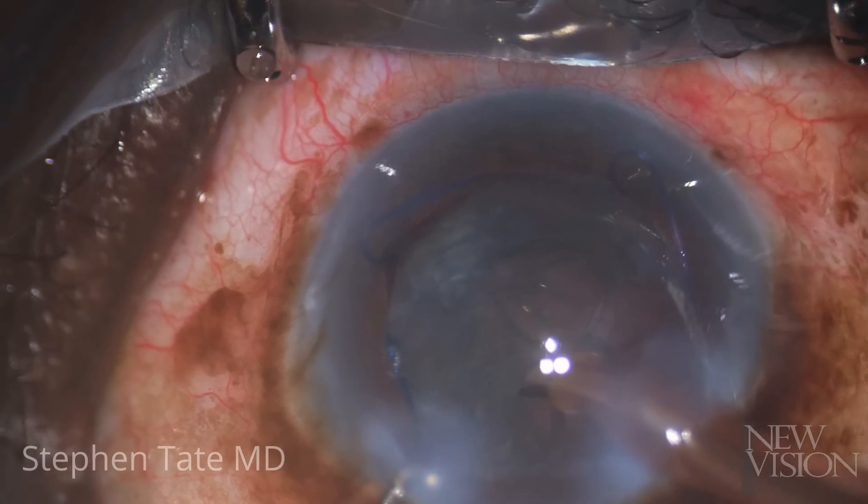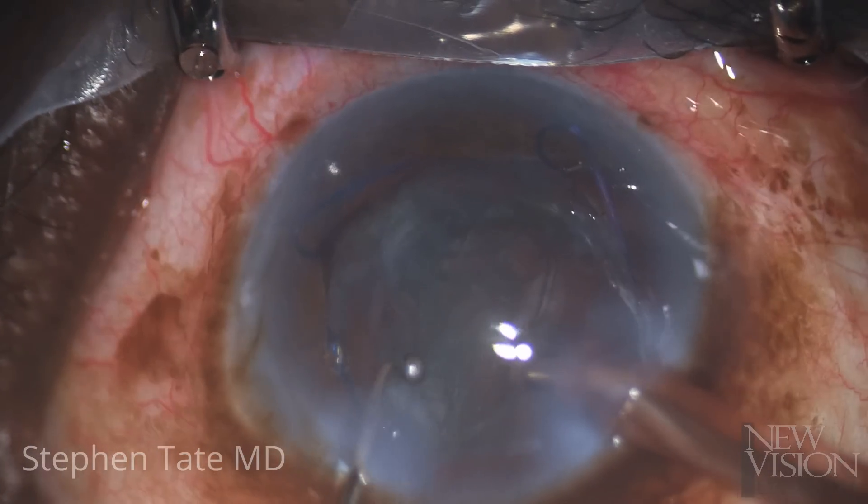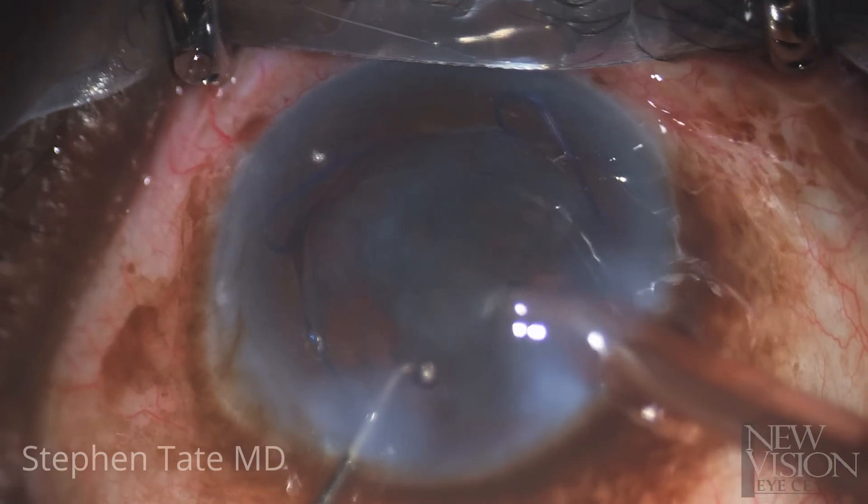Once most of the lens material has been sculpted away, the epinuclear shell is prolapsed out of the bag and aspirated away without ultrasound.